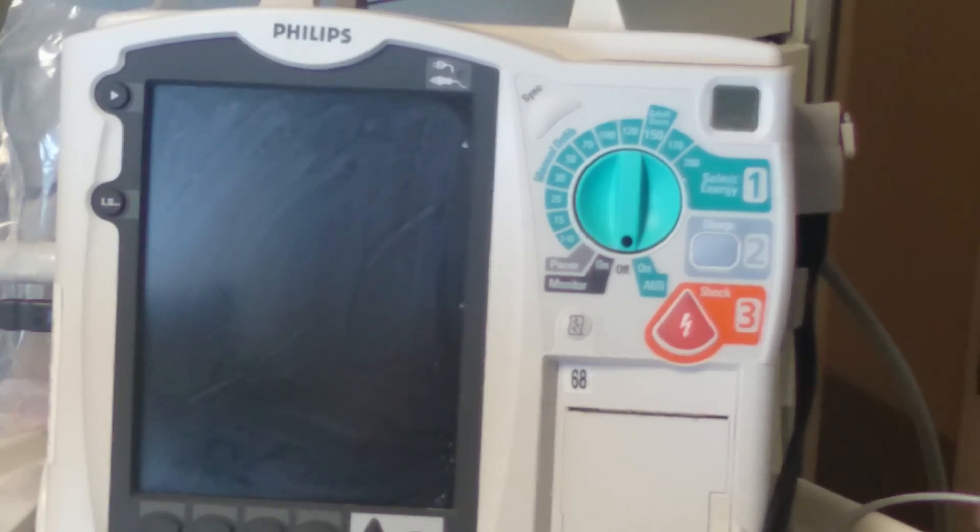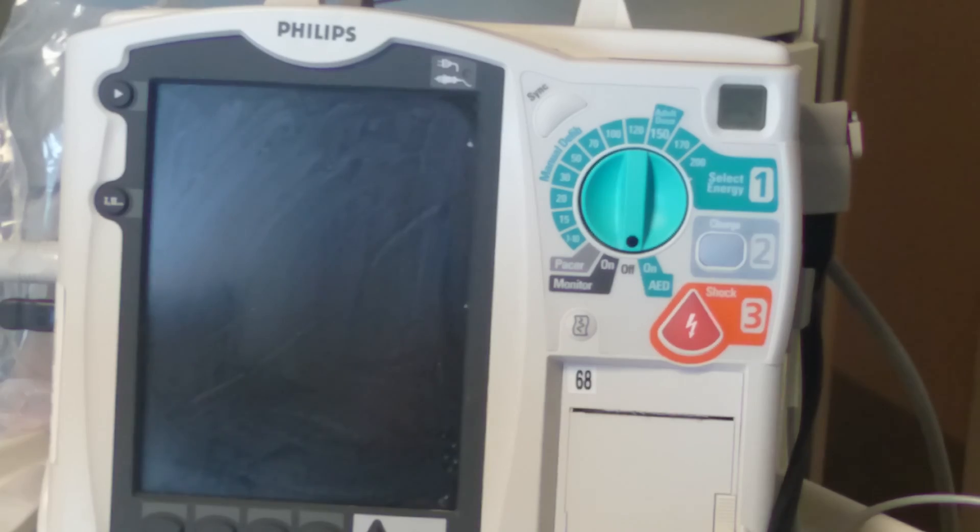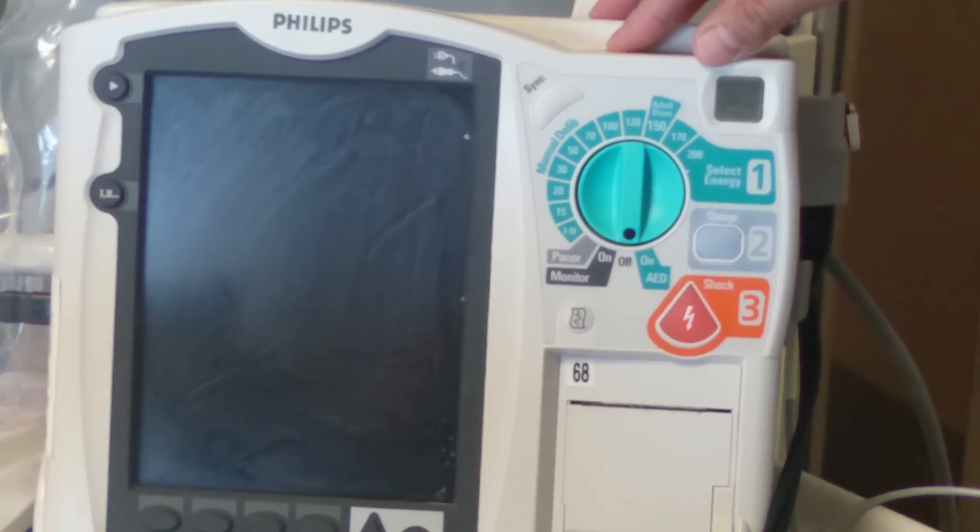If the X continues to show, you've got to call logistics and have the defibrillator switched out. Now onto the testing.